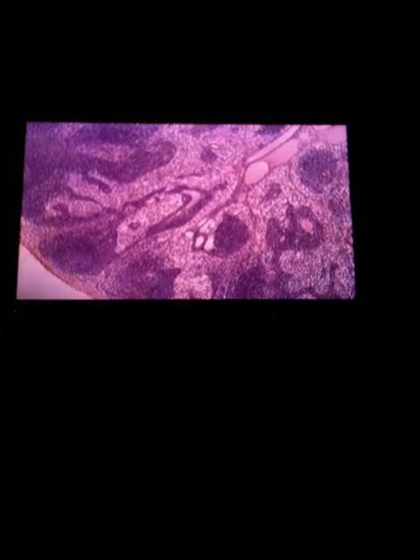If they were going to ask you, and what you don't see is a lot of the red, so this is not the spleen. You see all these weird structures, these mosaic-looking colors. These are all concentrations of what they call germinal lymph tissue throughout what's called a lymph gland. So this is a lymph gland, not a node, but a gland.